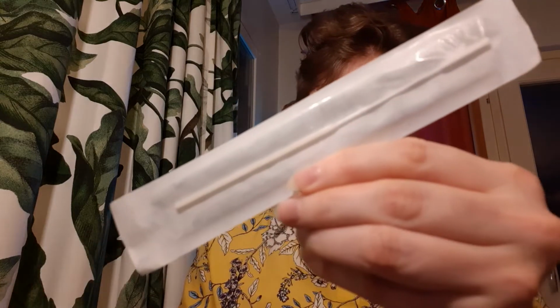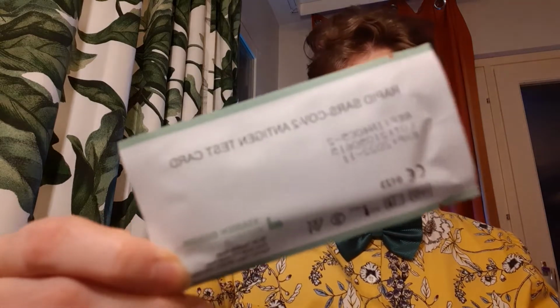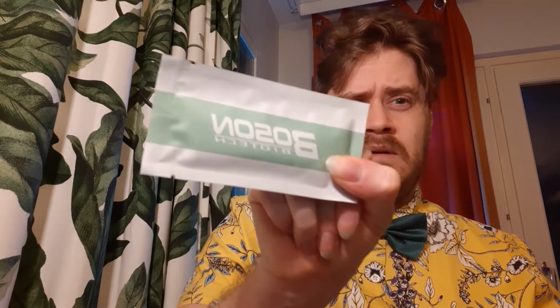That is the swab right there, just so you guys can see it back at home. It says disposable sampling swab. That is a lot longer than I think I'm interested in, but we're going to do this. We've also got the rapid SARS-CoV-2 antigen test card. You can see here, this is from Boson Biotech out of the Netherlands.